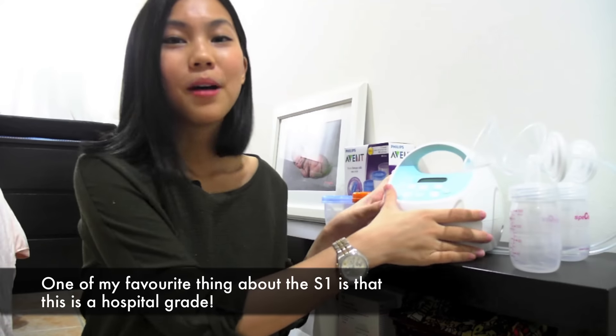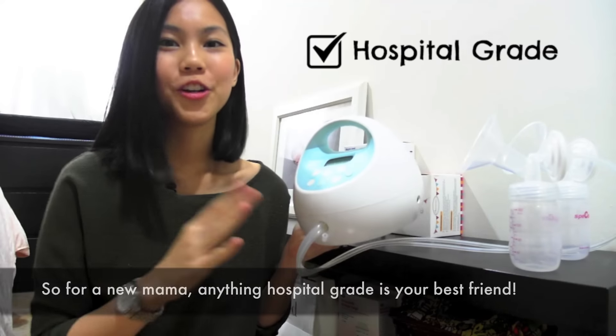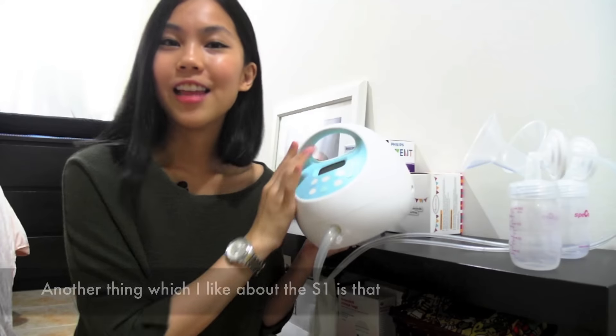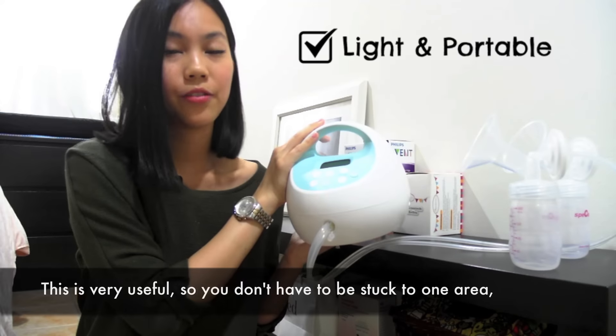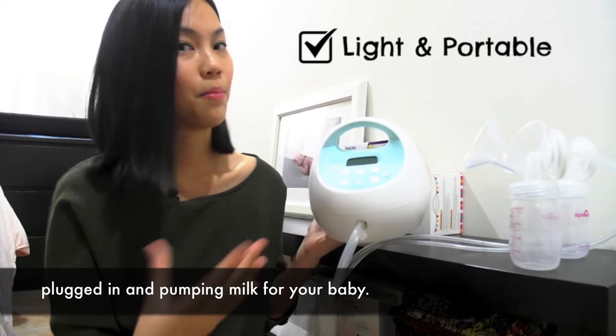One of my favourite things about the S1 is that this is hospital grade. For a new mama, anything hospital grade is your best friend. Another thing I like about the S1 is that it comes with a handle so it is light and portable. This is very useful so you don't have to be stuck to one area, plugged in and pumping milk for the baby.